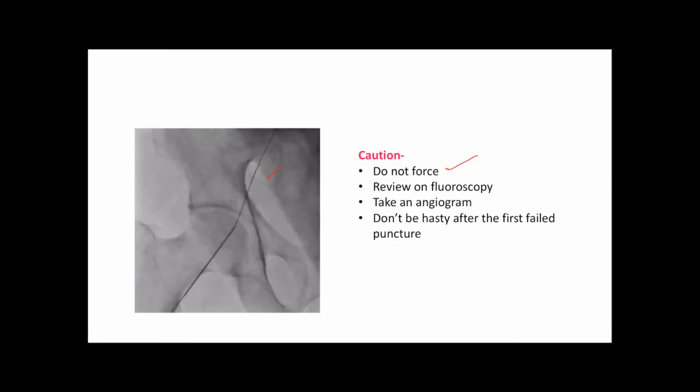This 2 minutes of waiting after a failed puncture is always rewarding, because if you get the puncture right the second time, the immediate reflex is that you give heparin to the patient, and when the heparin is inside the patient, whatever small or inadvertent puncture may have happened will continue to bleed all through your procedure, and it will create problems later when you are done with the procedure.